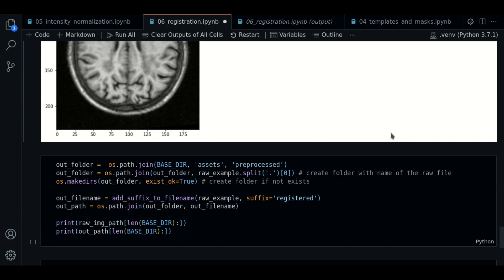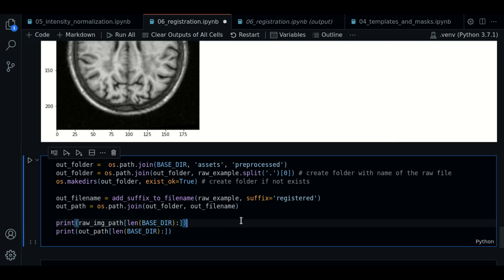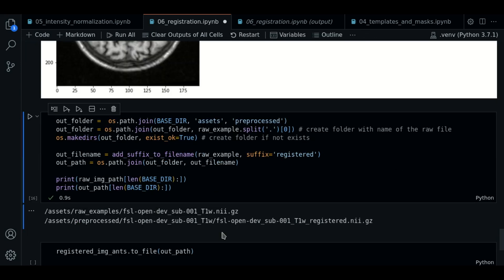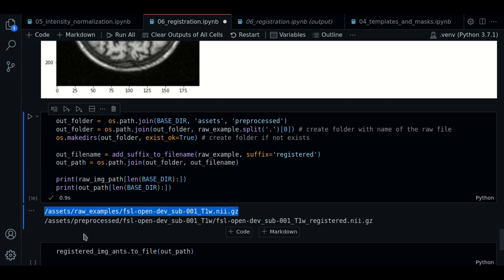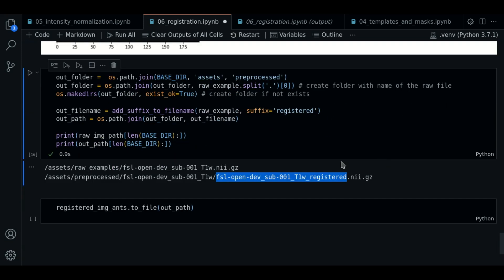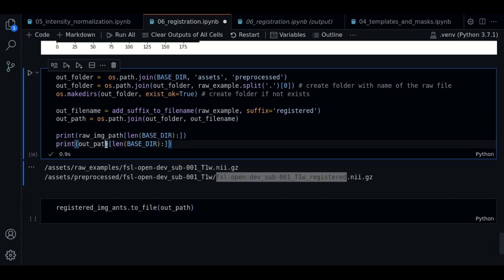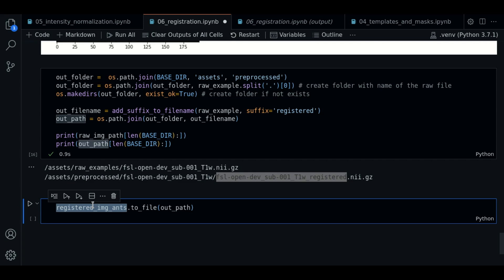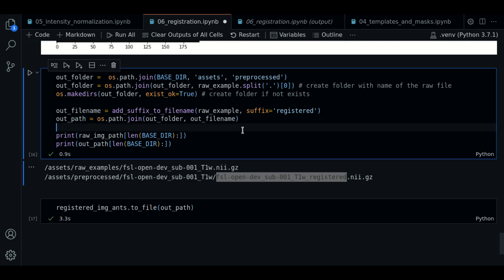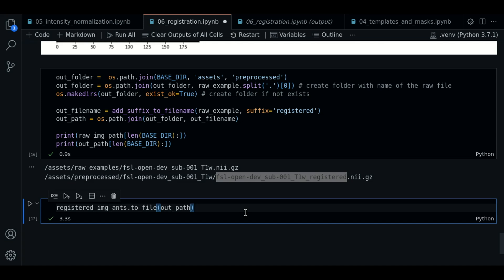So the next thing I'm going to do now is to save the result. So here I have the same snippet for saving images as before. So I print out the path of the raw image and the path of the new image, which is the registered image. So I'm going to call the method to_file. It takes the path. And when I execute this, this should save the image.